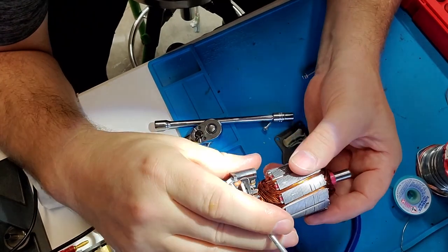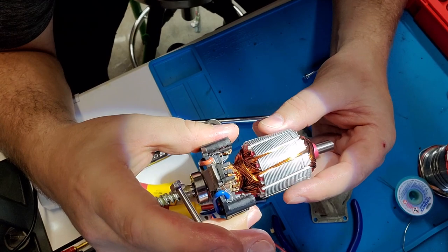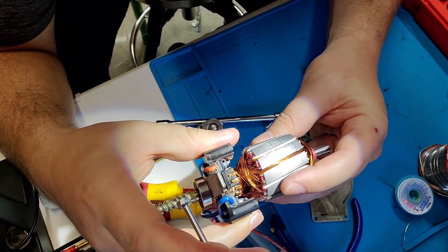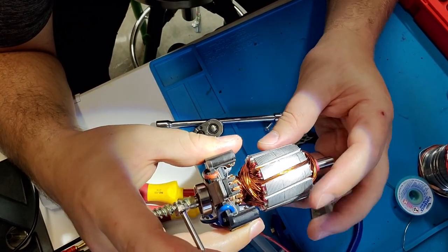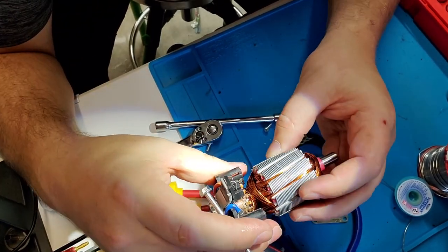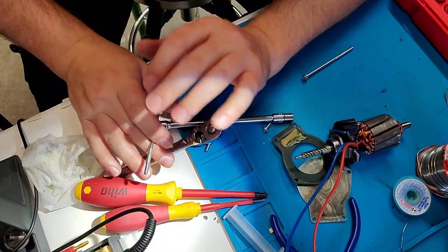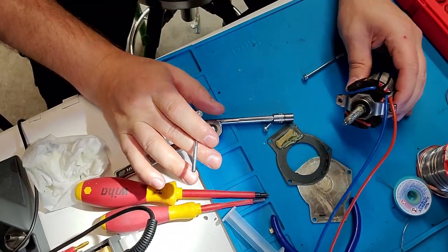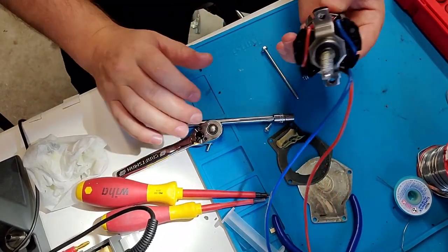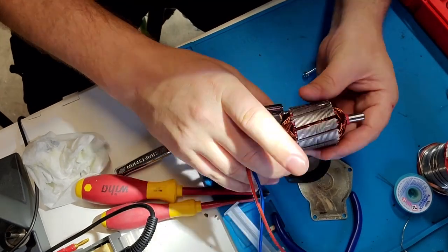This one does not have that, but it's a low use product, so it's probably going to outlive whatever vibrations it gets, especially since they balanced it so well. But normally these would have some sort of epoxy. If I were to pull apart one of the motors for a power tool, guaranteed they're going to be epoxied. That's just because it's probably a higher use tool, but it is what it is.